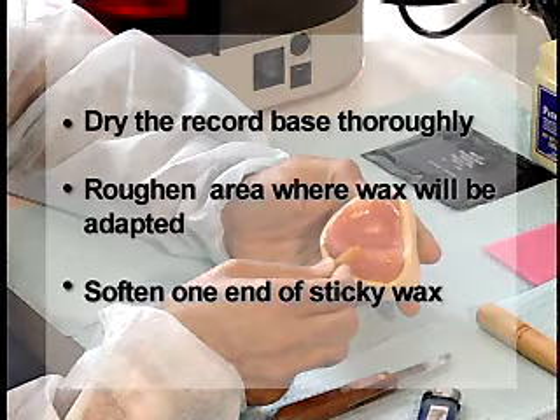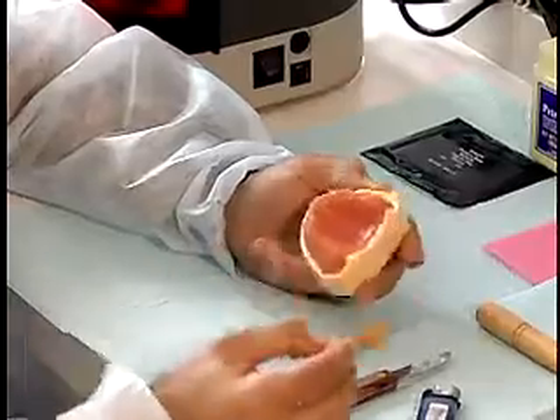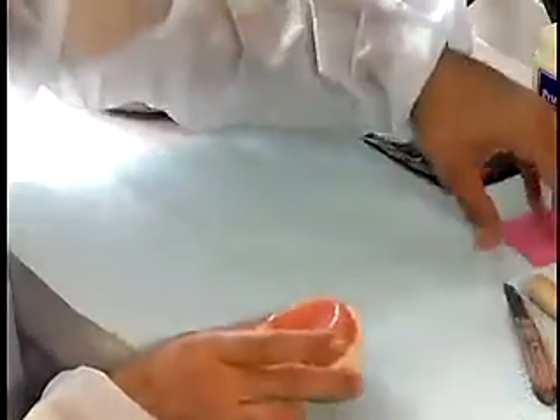Soften one end of the sticky wax slowly over a Bunsen burner flame. Place the sticky wax over the ridge crest area of the record base.